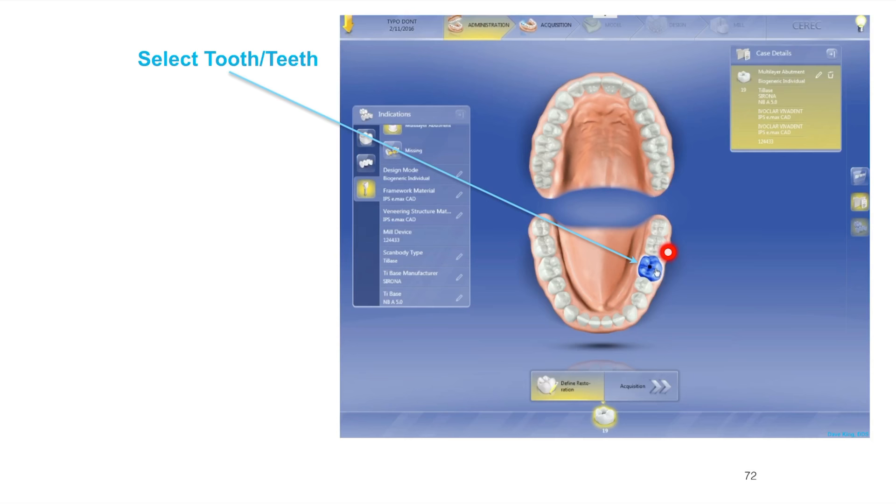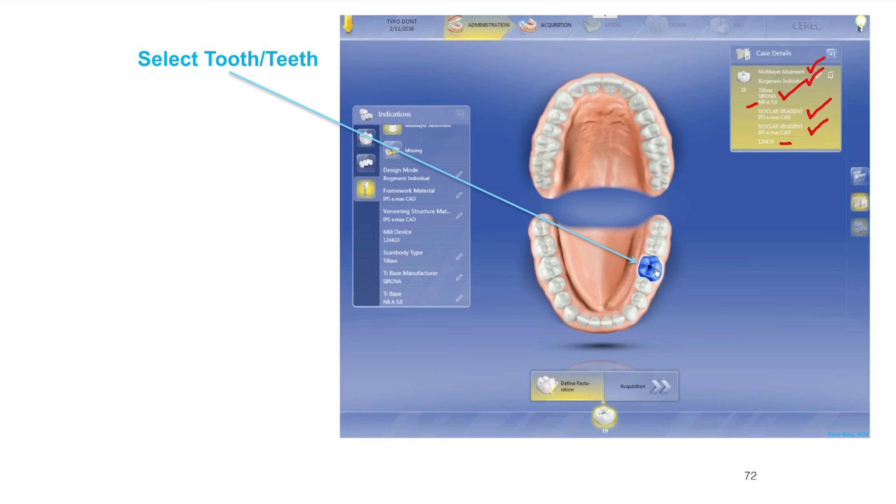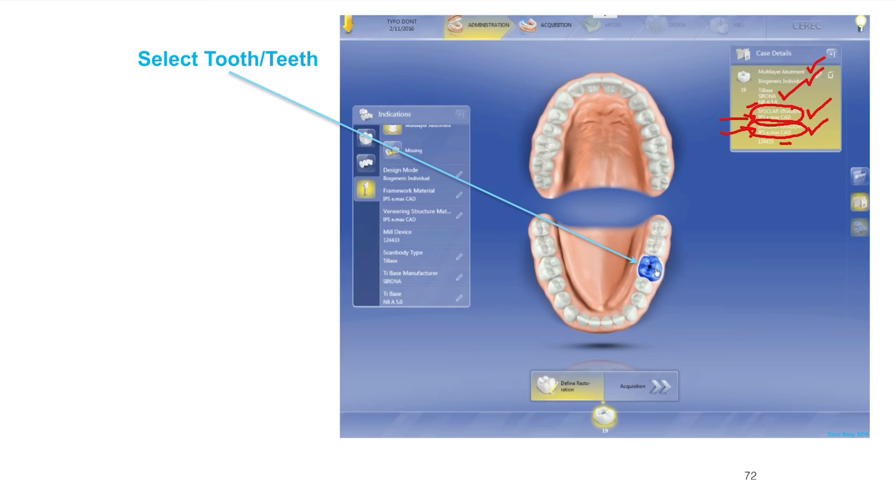Last, we want to select the tooth that we're using. For our intents and purposes today, we're doing tooth number 19. Let's review what we have. We've got multi-layer biogeneric individual, we're using a tie base, this is the Nobel Active 5.0 that's a regular platform. The framework structure is Emax and so is the veneering structure. Remember these do not have to be the same. You can make the abutment out of Emax and make the crown out of Empress or Vita or Lava Ultimate.